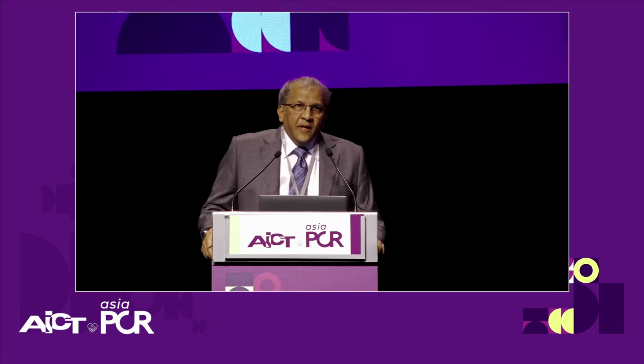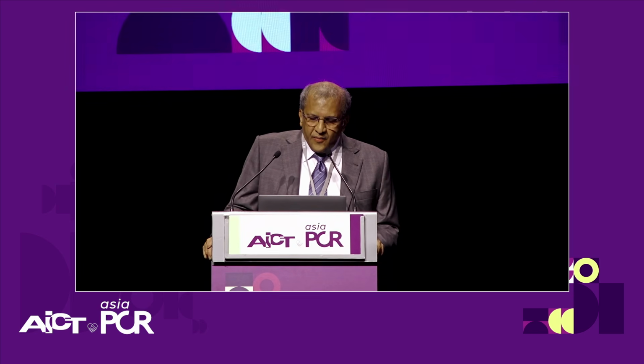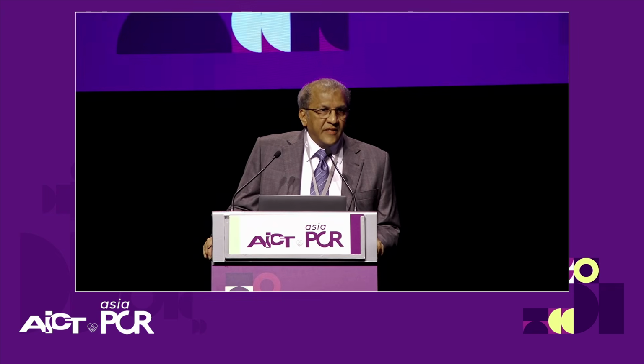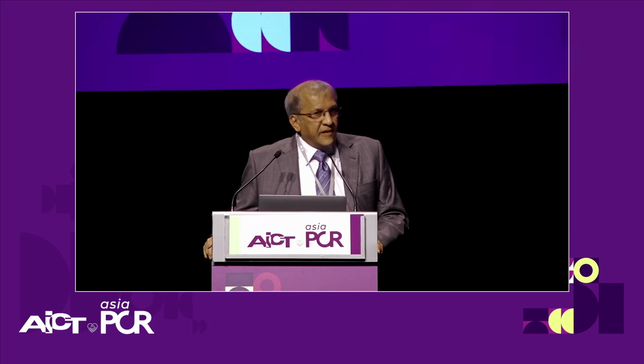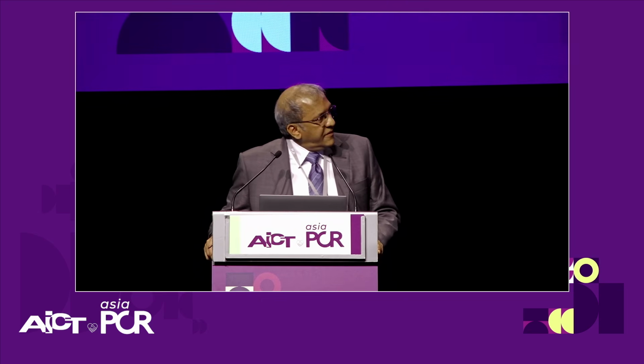Right. So yes, IVL can be used for underexpanded stents, but I think we might have a technology in excimer laser to use for underexpanded stents as well. I think it's an area which needs a lot of work, and I would love to see some data showing one better than the other, but we have maybe these two technologies at the moment.